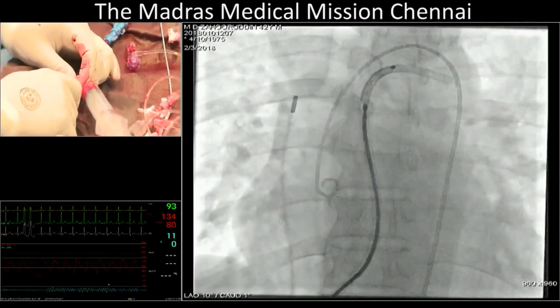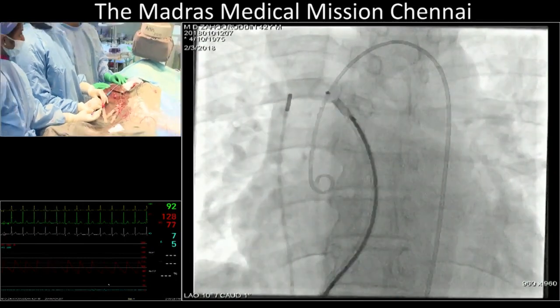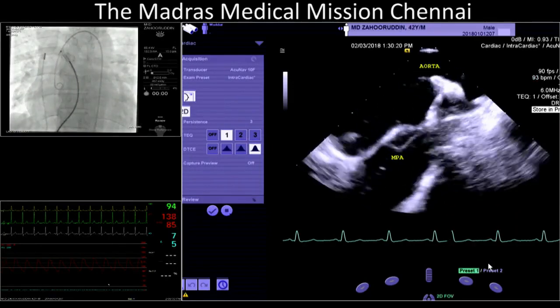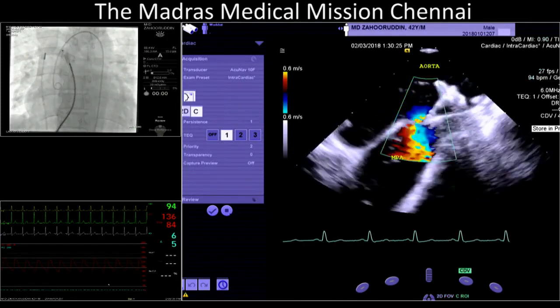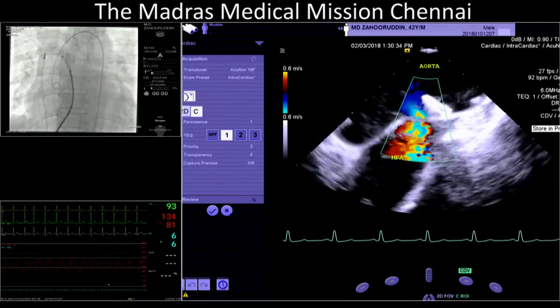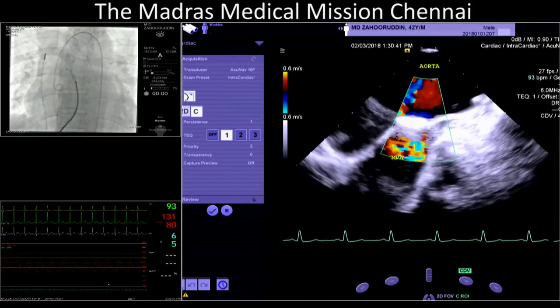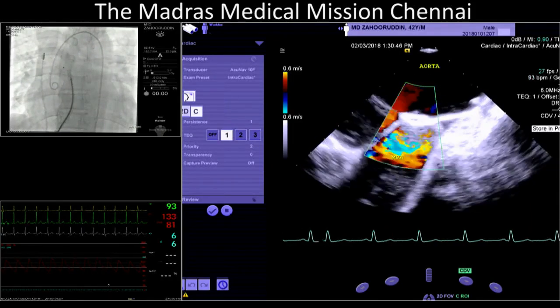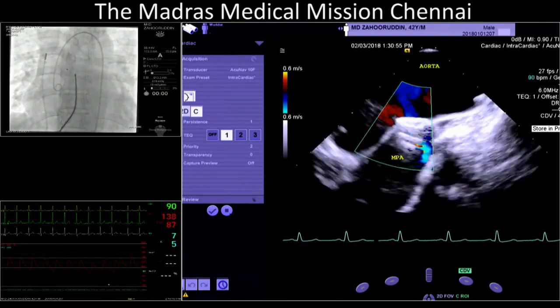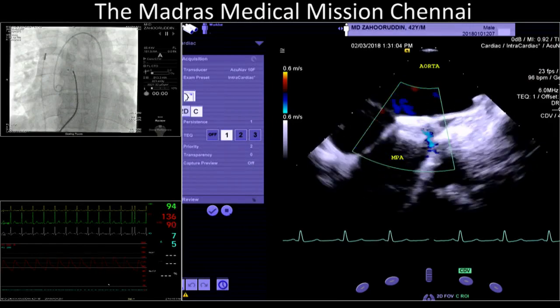Keep recording. Intracardiac echo big, fluoroscopy small. Color the AP window — that is a very nice picture. The waist looks a little bit small, but since I have gone to 20 millimeters on the aortic side, I think it should work. Ten patients experience so far — I think the most in the world; you have to publish it. So now the device is in. I am pushing it up.